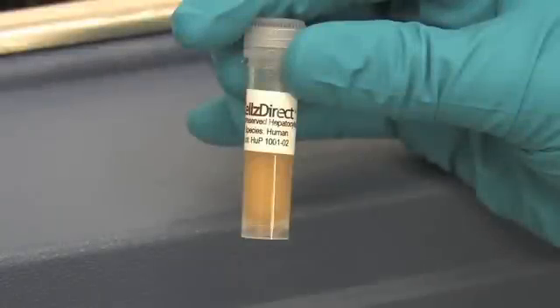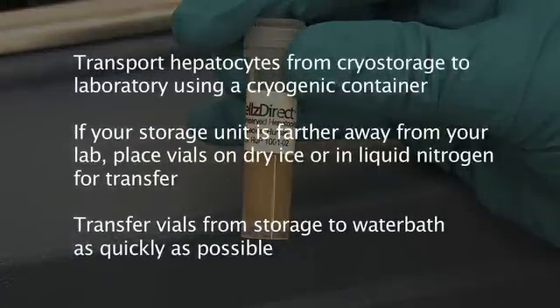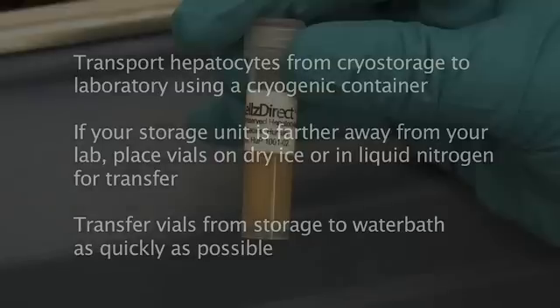Transport hepatocytes from cryo-storage to the laboratory using a cryogenic container if at all possible. If your storage unit is farther away from your lab, place vials on dry ice or in liquid nitrogen for transfer. Vials should be transferred from storage to the water bath as quickly as possible.